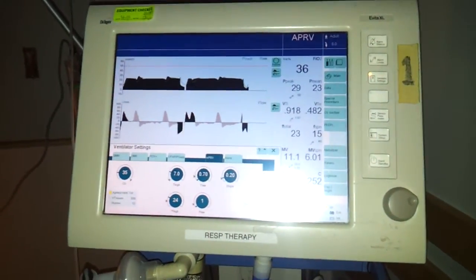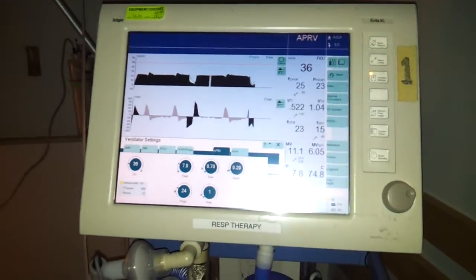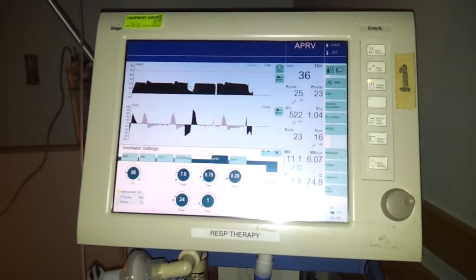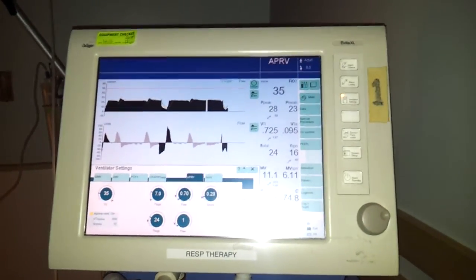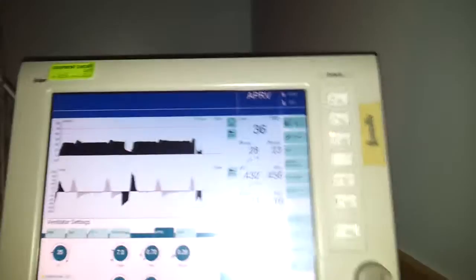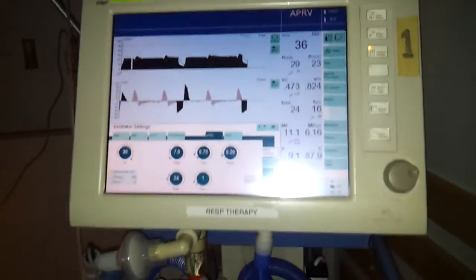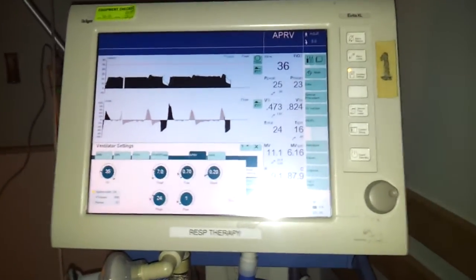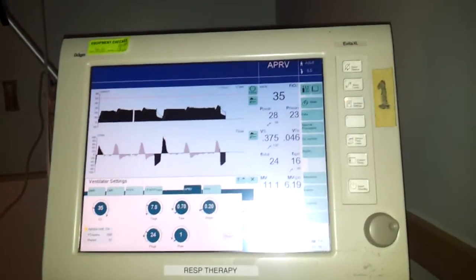I got a request to go over APRV, so I'm just going to be going over the basics of that mode. I'm going to be doing this on the AVIDA XL, which is a ventilator not a lot of you will be really familiar with right away.